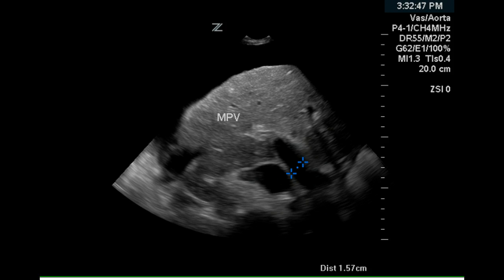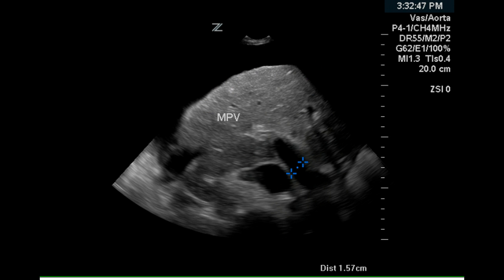This is a hepatic doppler examination of a patient who has portal hypertension. On this image we can see that the liver is increased in echogenicity and has a mild lobular surface along the capsule.